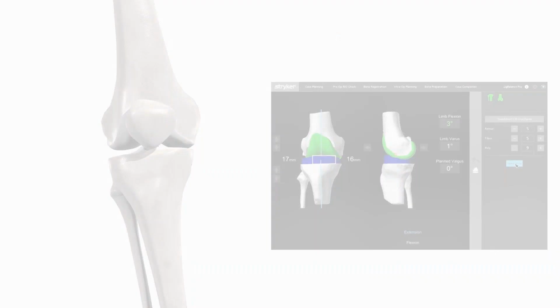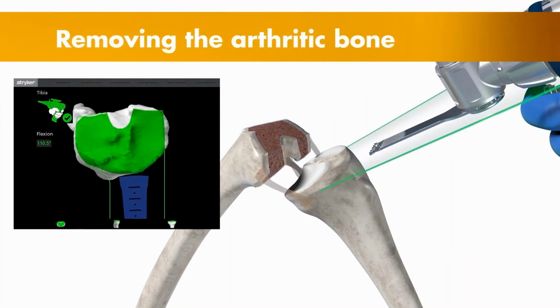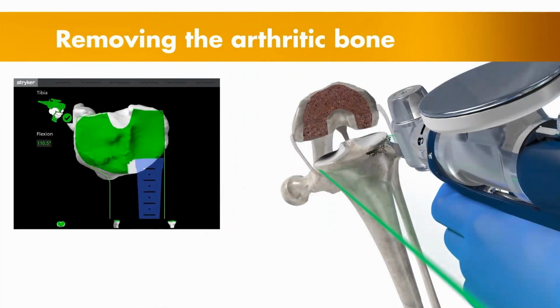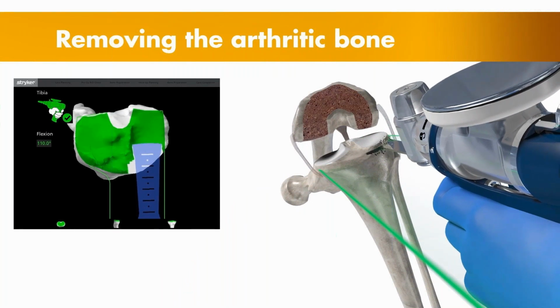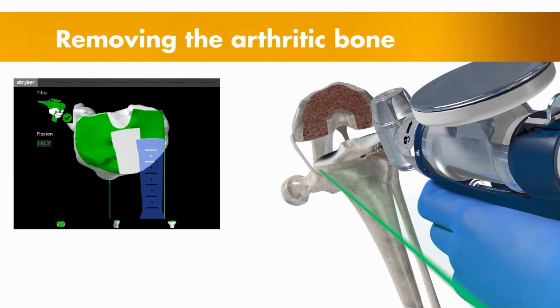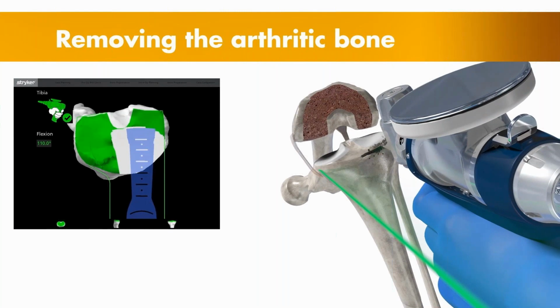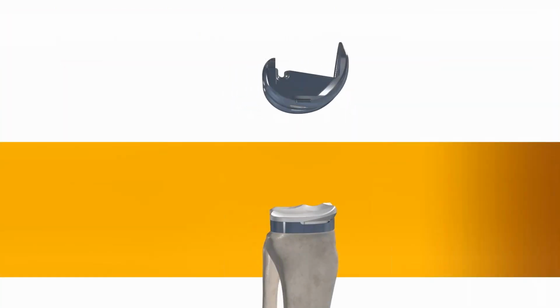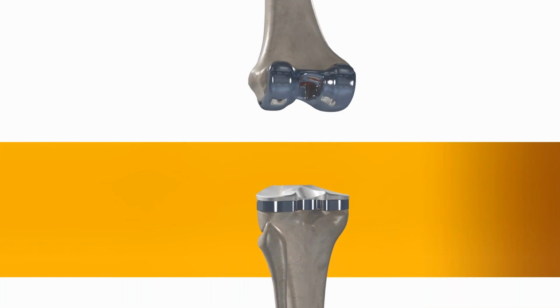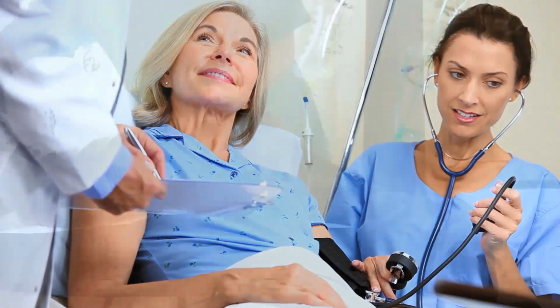Then, the surgeon guides the robotic arm to remove the arthritic bone and cartilage from the knee. A virtual boundary provides tactile resistance to prevent the surgeon from removing more than just the arthritic bone identified in the preoperative plan. And visual cues, shown in green, appear on screen to show how much bone to remove. Collectively, these cues help the surgeon stay on the preoperative surgical plan. With the diseased bone gone, the knee implant is inserted into the joint space, and once the surgeon is comfortable with the knee's movement, it's off to the recovery room to begin the journey towards strengthening the knee joint.